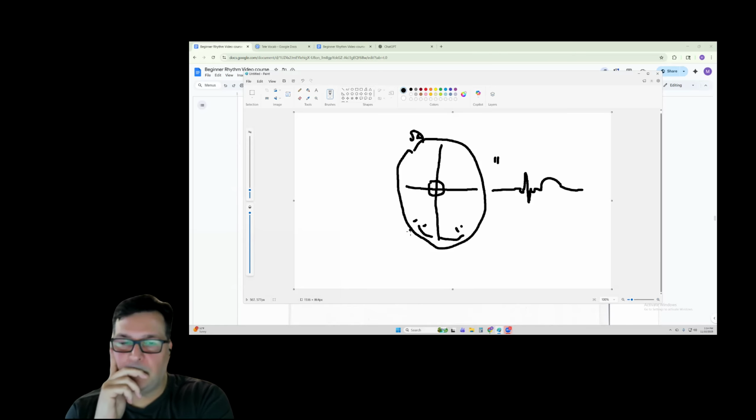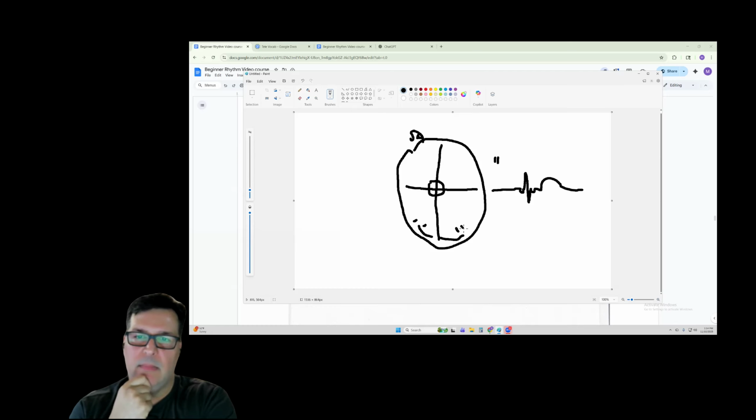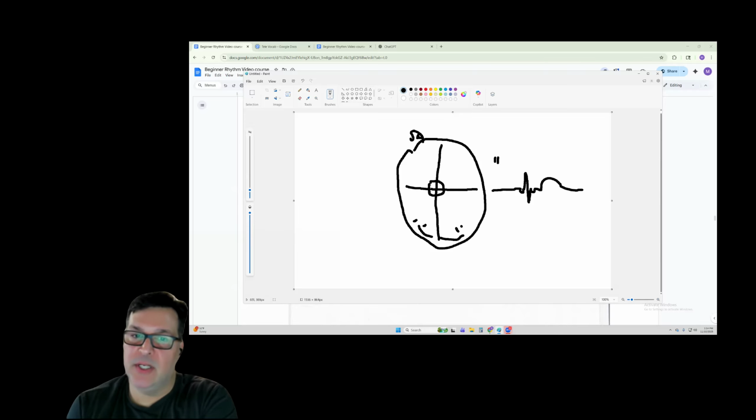So Kristen just asked, what if it's less than 0.12, but positive? Oh, so what she's asking is, what if it doesn't fit the criteria of junctional? Like say for instance, the PR is less than 0.12 but still positive, or it's negative and the PR is greater than 0.12.